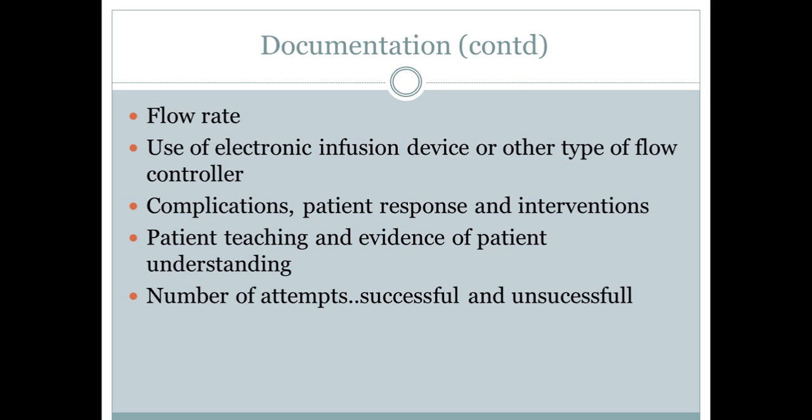Let's say patient states feeling lightheaded while sitting during IV insertion. So then my intervention might be to place that patient's head down, the head of the bed down, maybe get a cold washcloth on their head, distraction. I would try to do things that would help that, as well as document those interventions to show that I did respond to what was going on with the patient.